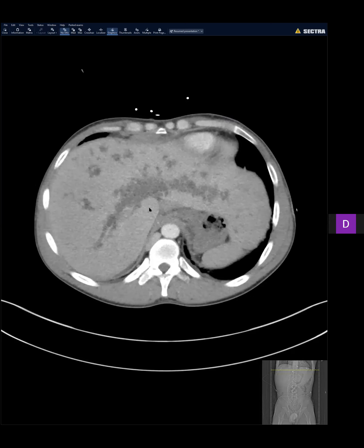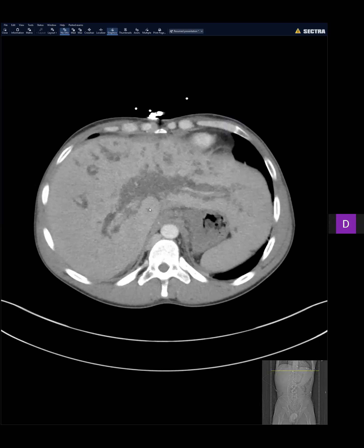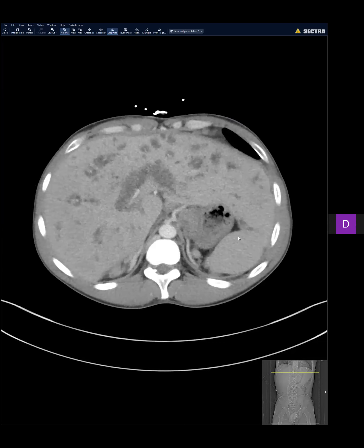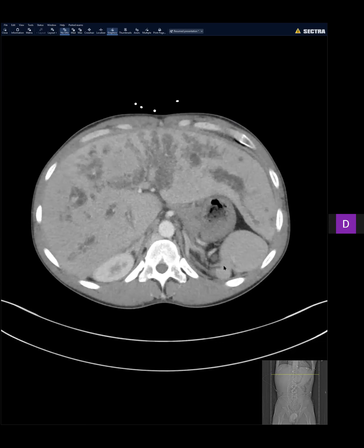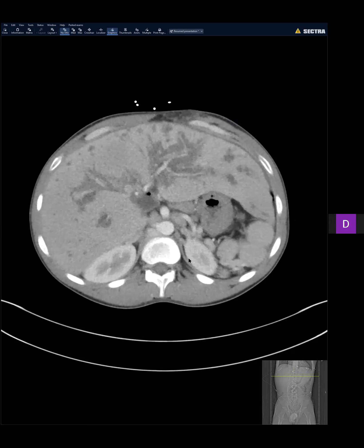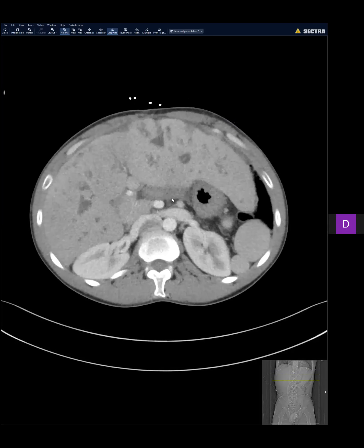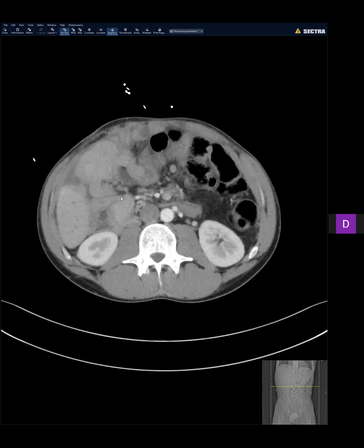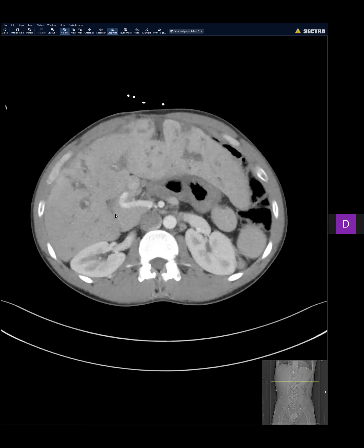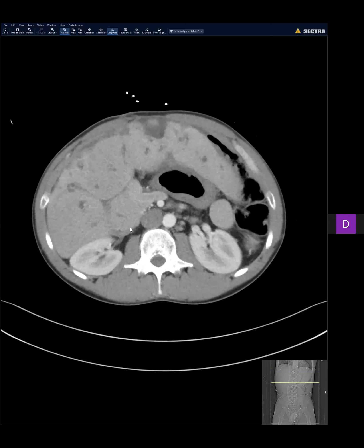There is polysplenia and malrotation. The SMV is on the left. Subnormal pancreatic tissue — they called this a mass at an outside hospital, but I think it's just the pancreas.